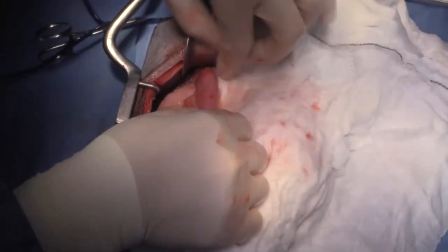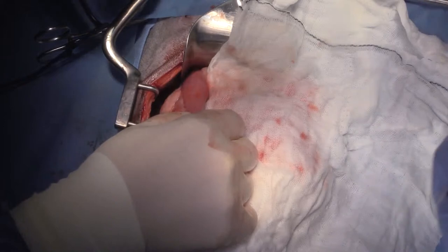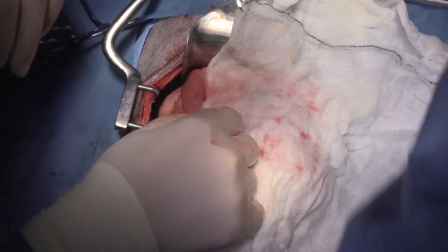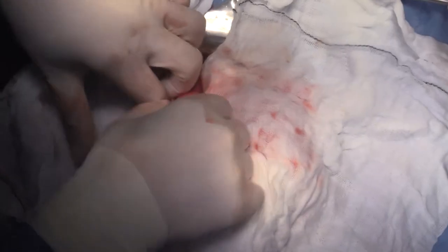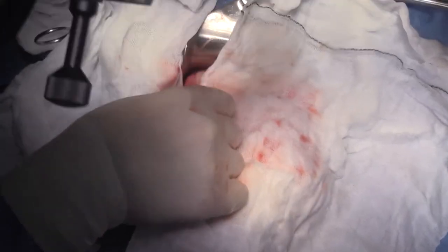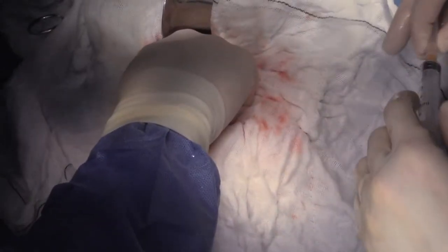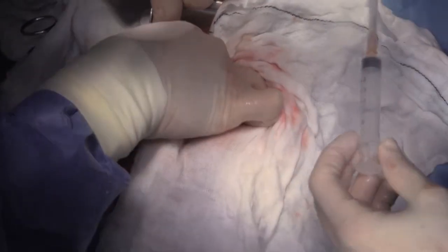And on ultrasound, we're very confident that the, another swab, please, Jeff, that the common bile duct wasn't dilated, and we could see it and visualize it nicely coming up into the cystic duct with all the lobar branches of the biliary system. So I'm just going to pop a needle into the lumen of the gut here to see if we can identify any bile flow or not. With the gallbladder, a gentle squeeze, we're not going to achieve much because of the condition that we're dealing with.